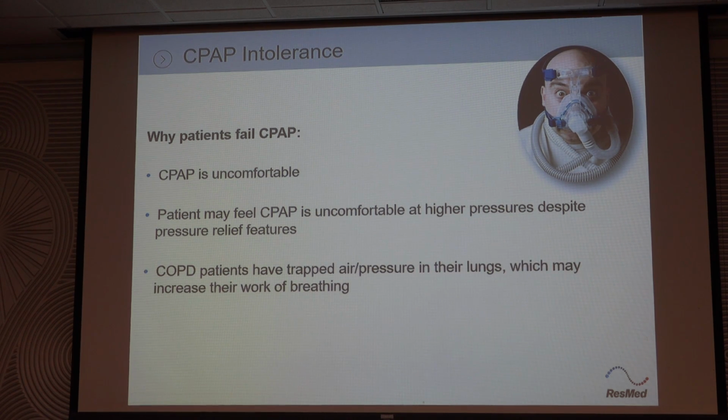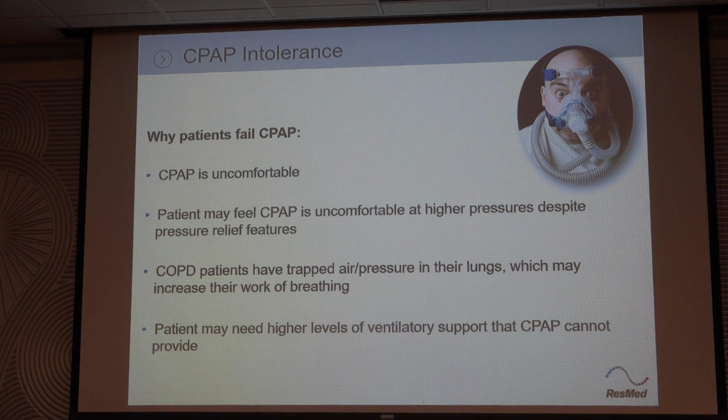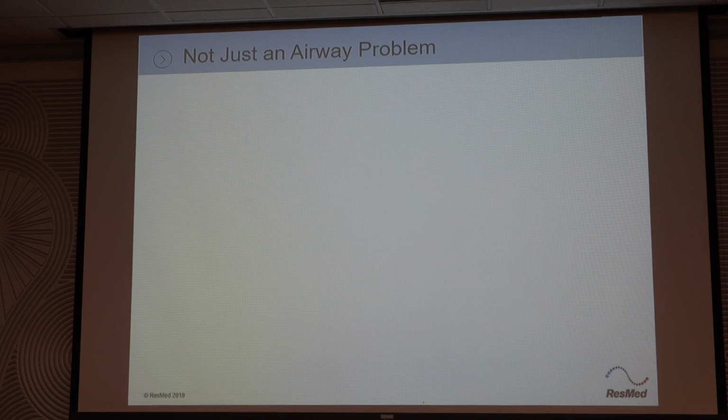Knowing that, yeah, they may have OSA, but they may have COPD also. That can be an issue because the CPAP may make them worse. They can't exhale against it. So CPAP probably isn't going to be the best choice for those patients. Bilevel probably is going to be smarter. And they may have other diseases, neuromuscular, like ALS. A CPAP probably keeps the airway from collapsing, but they probably need help ventilating. So knowing that up front will lead you to believe, I don't think CPAP's going to work on that. You can pin it down if you're looking at someone going through a sleep study or someone in the hospital.